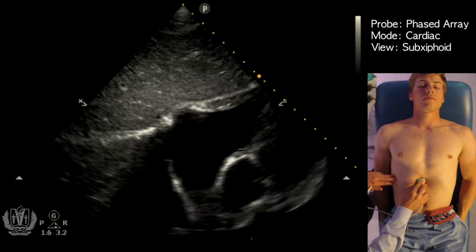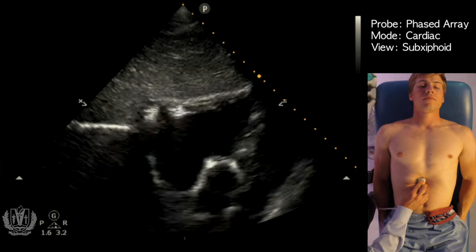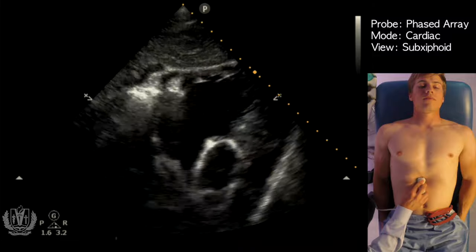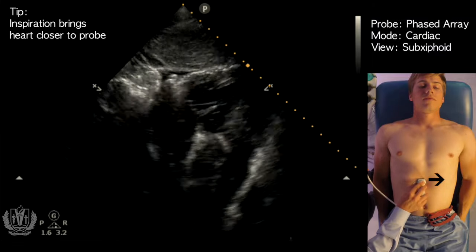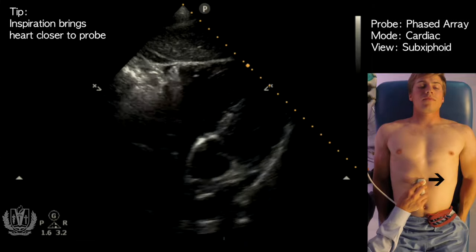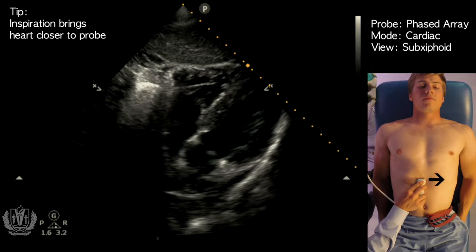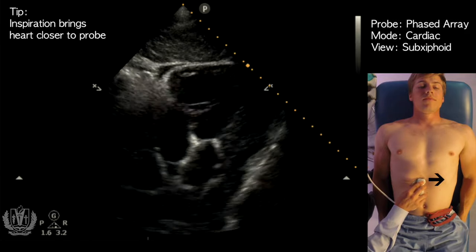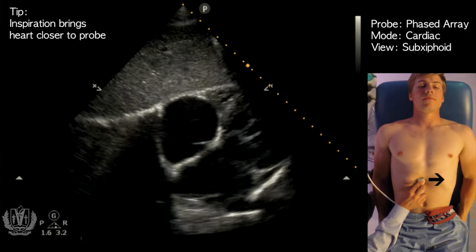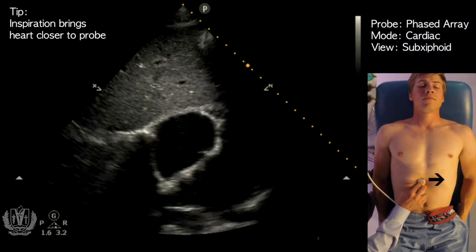Here the heart is coming into view. I'm going to adjust my depth — a lot of times you have to increase your depth for this scan. We'll have the patient take a big breath in, and that brings the heart even closer to the ultrasound probe, giving us a better view. Okay, you can breathe out. Take another big breath in and hold it.